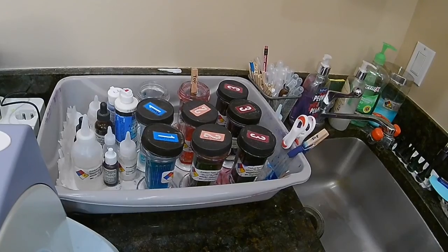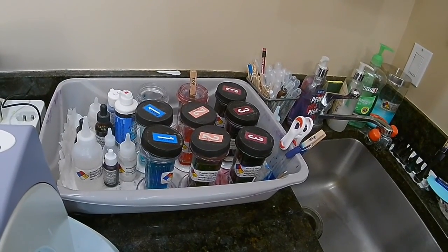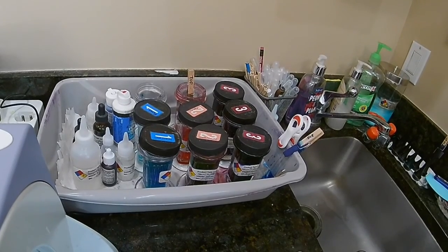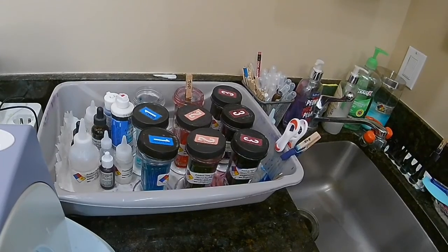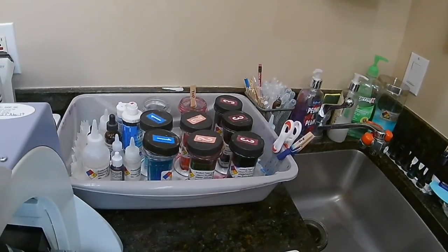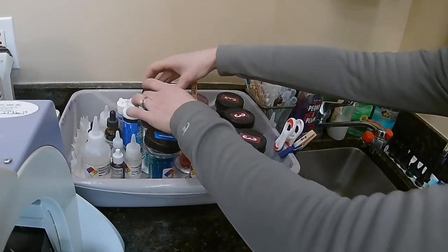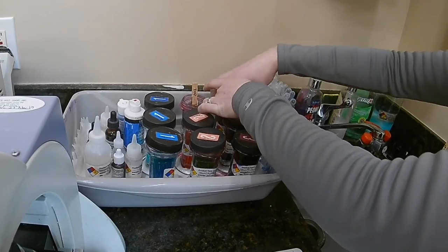Stains can vary on how long you'd want to put them in there, based on how old they are. How thick your sample is might make you want to leave them in a little bit longer, or how dark you want your slide to be. Okay, so I think that's good. I'm going to cover that up real quick and get ready to switch over to the next one.